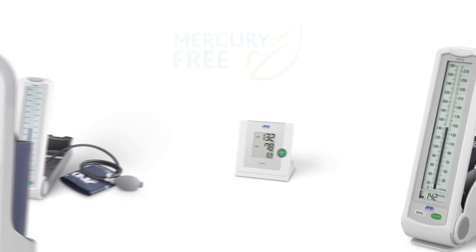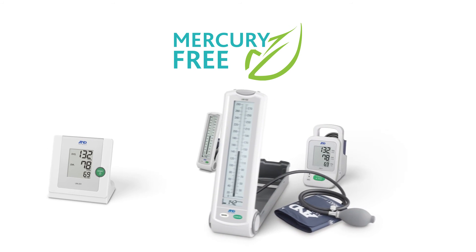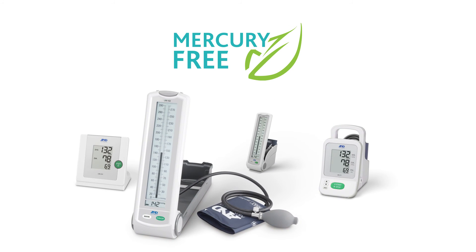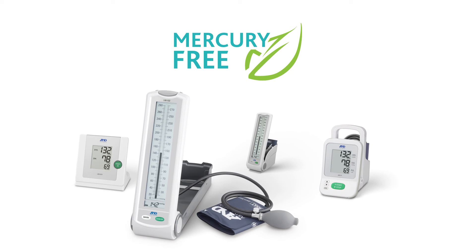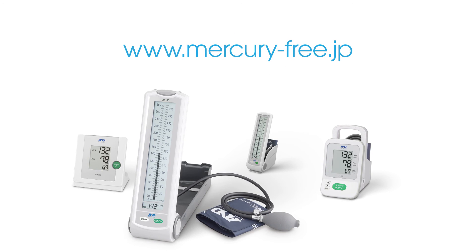The Minamata Convention on Mercury will become effective in 2020. It is time to make the switch to mercury-free. We believe you can find a mercury-free blood pressure monitor that suits your needs in our UM-Series lineup. For more information about mercury-free and the UM-Series, please visit www.mercury-free.jp.